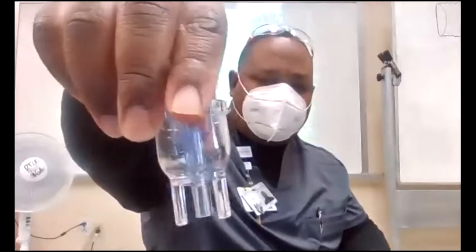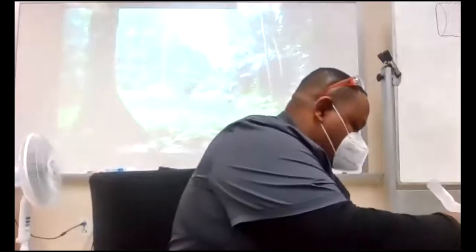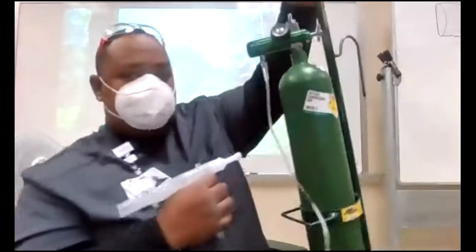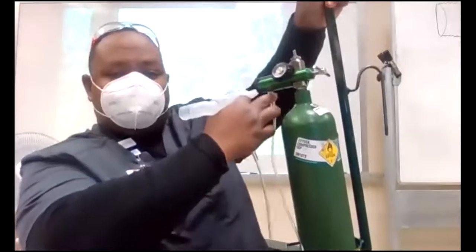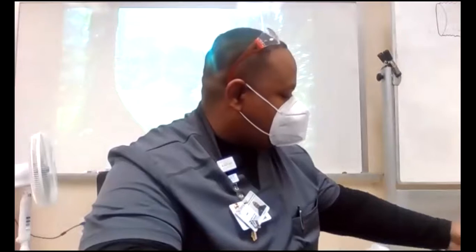So usually your medicine will look about like that, about 3 mL. The breathing treatment usually comes in pre-made little vials, 3 mL. So I would have my medicine in here, put my top back on, put this on, and my tubing. One tubing goes to my oxygen cylinder or my oxygen flow, wherever I'm getting it from, the wall or whatever. And the other end goes to my actual nebulizer. See, I've got it hooked up here. What is the safety system right here called? The DISS. Everything after the regulator, the DISS. So I will cut this to about 8 liters.